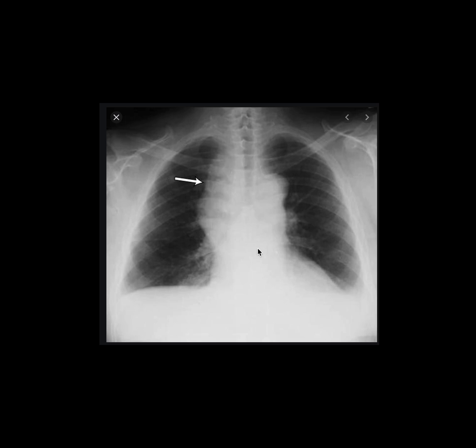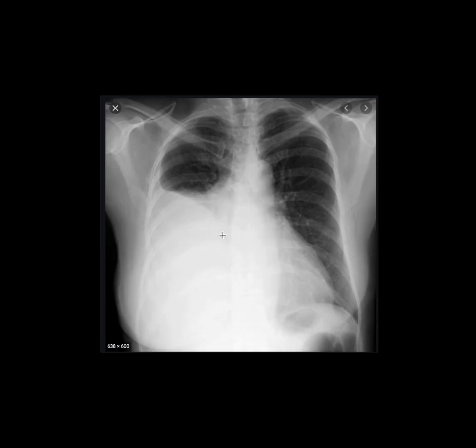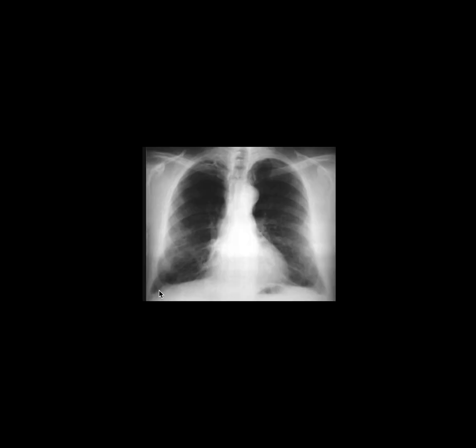Even here in the mediastinum, you can see slight haziness around the heart, suggesting pleural effusion. Again here, you can see that a lot of the lung has been involved — the pleura has become hazy, and the costophrenic angle on one side of the lung has completely disappeared. Another example: again the pleura is hazy and the costophrenic angle becomes hazy.